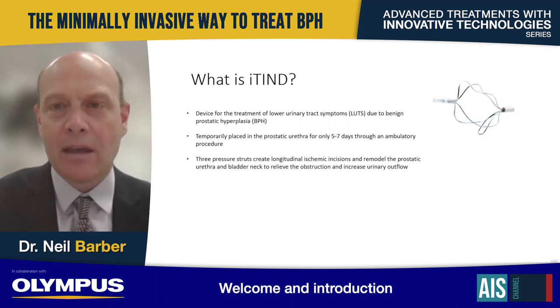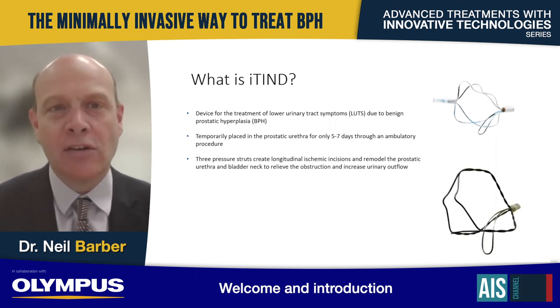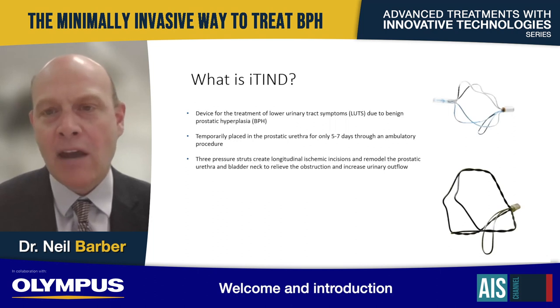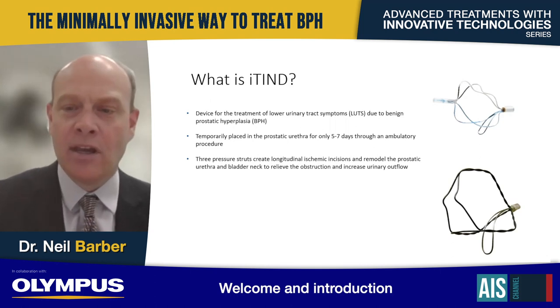Today, we're going to talk about different aspects of the device, but I want to reinforce that this is not a new device. The first picture in the top right there is version one of the iTind, and you can see that was made up of four struts. The first 1 year data was published out of Professor Francesco Porpiglia's unit in Torino nearly 8 years ago now. Thereafter, the second generation device, in the bottom right hand there, came along, and that's made up of the three struts that I described in this positioning leaflet. And all evidence based following that was based upon using this device.